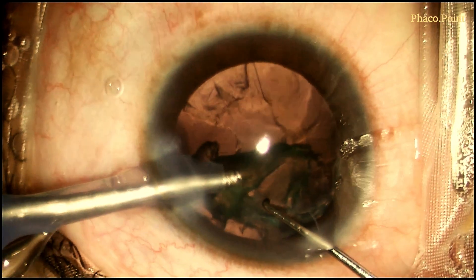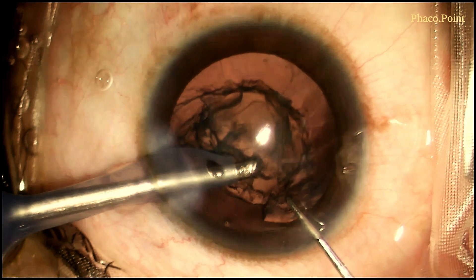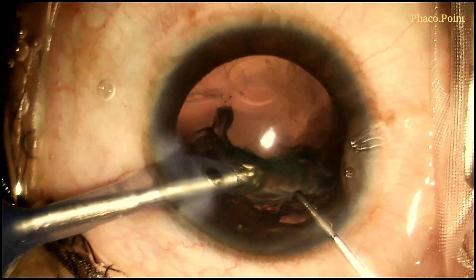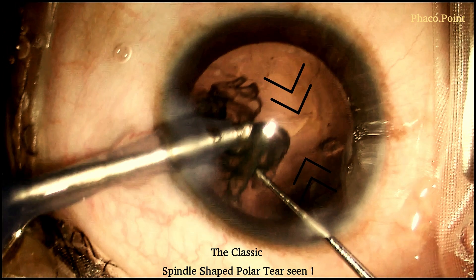With care and caution, the epinucleus is dislodged from within the capsular bag and is aspirated. Whilst removing the last part of the epinucleus, the horizontally located spindle-shaped tear of the polar cataract comes into view.